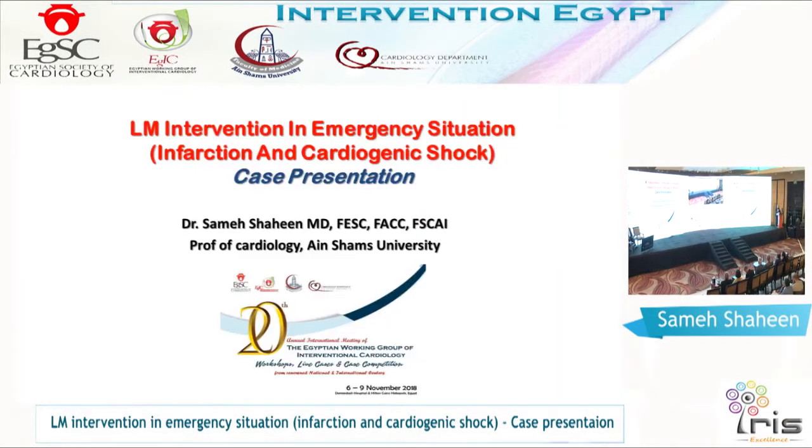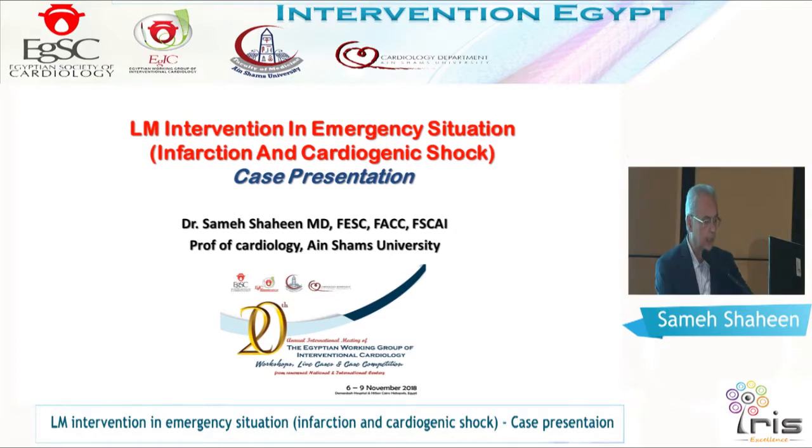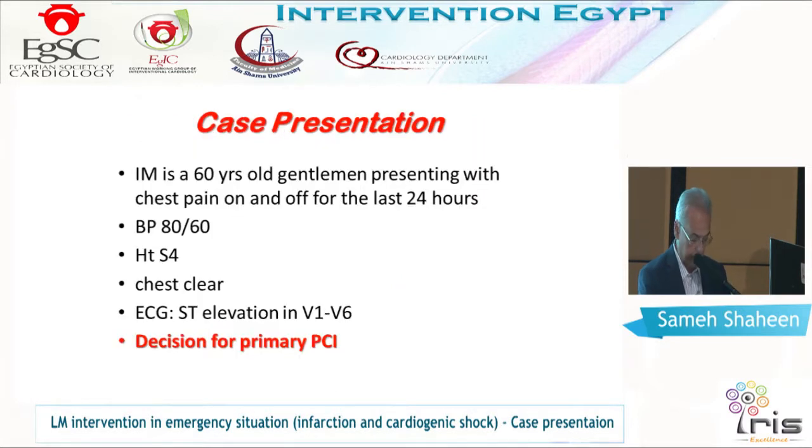نرجع لأرض الواقع من this fantastic session of TAVI, which is actually becoming an everyday practice abroad. لكن هنرجع تاني للpractice in Egypt, and I'm presenting a case of STEMI, which is now an everyday practice in our country.